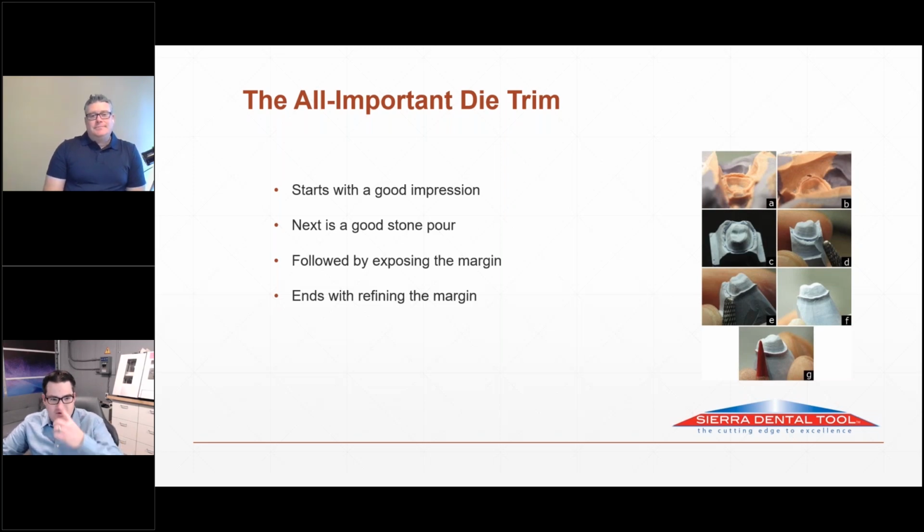And then I've got a little bit of a spiel on die trimming, I guess you could put it that way, just for digital. When you're trimming a die for manual processes, it's user preference, but there actually is some nuance to doing it for digital. The point is that you don't want to over ditch it or under ditch it. You want to go right down the middle.